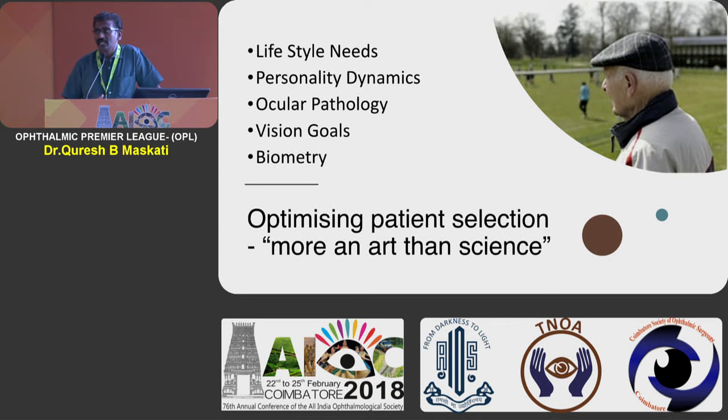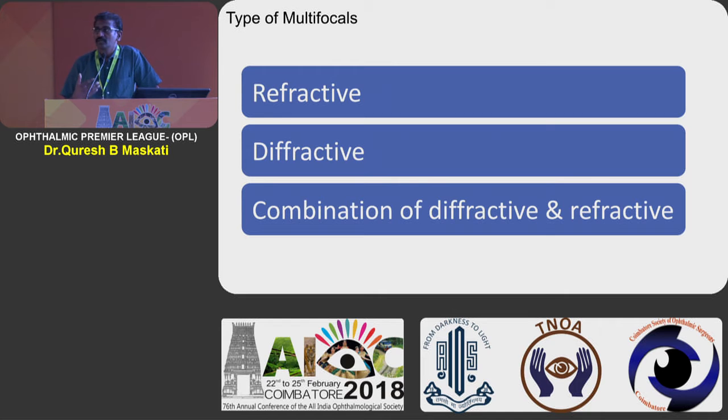So it's more of an art than science. We keep talking to the patient, and we develop our own skills. We have evolved from a period in 1983, when Hoffer did the first multifocal lens, with a decentered lens, the dual focus, one through the aphakic and the other through the phakic part. Now we have come to the level of neuroadaptation, talking to the patient about various newer terminologies. Then came the diffractive lenses, and after a period of time, slowly a combination of diffractive with refractive, which is what I'm going to stress more upon, and which I'm more comfortable with.